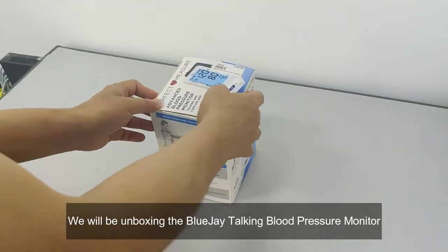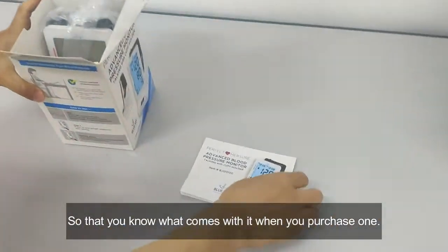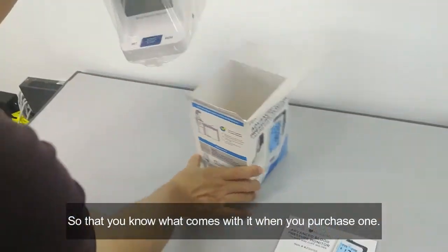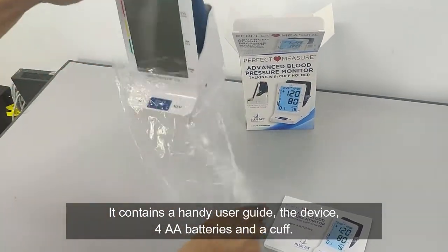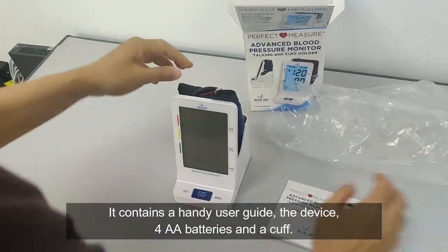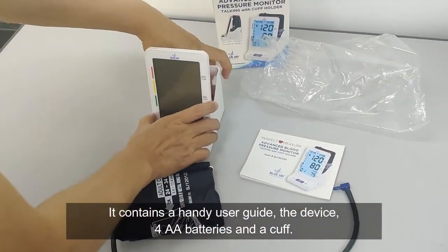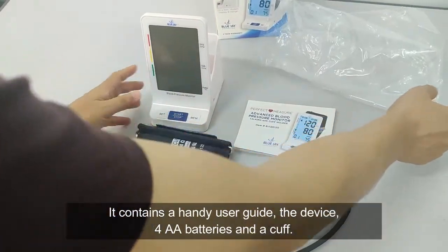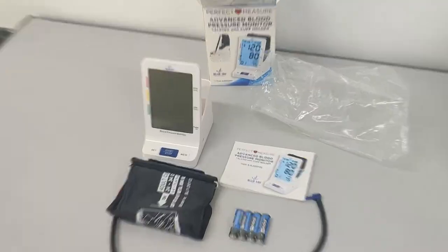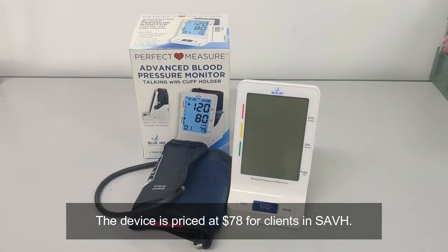We will be unboxing the BlueJ Talking Blood Pressure Monitor so that you know what comes with it when you purchase one. It contains a handy user guide, the device, four AA batteries, and a cuff. The device is priced at $78 for clients in SAVH.